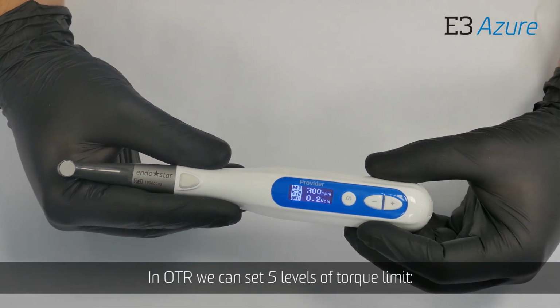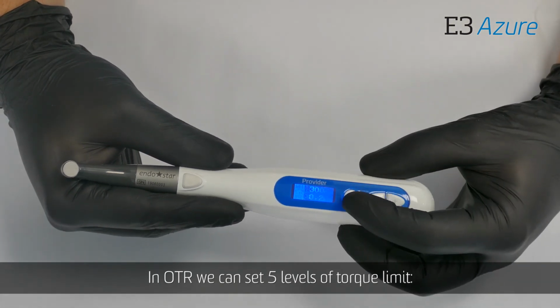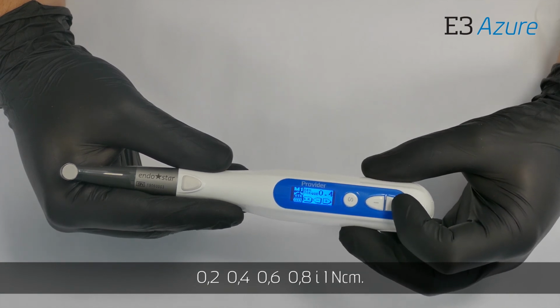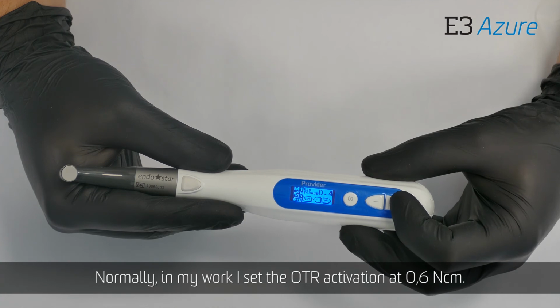In OTR, we can set 5 levels of torque limit: 0.2, 0.4, 0.6, 0.8 and 1 Newton centimeter. Normally, in my work, I set the OTR activation at 0.6 Newton centimeter.